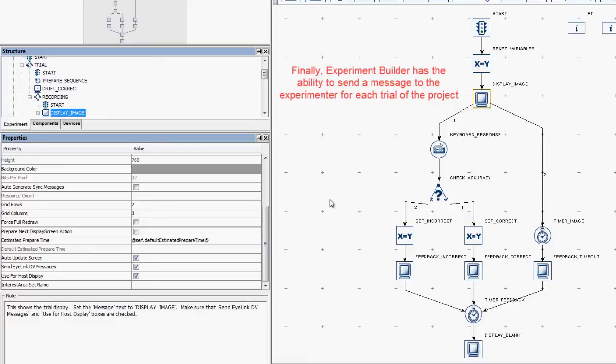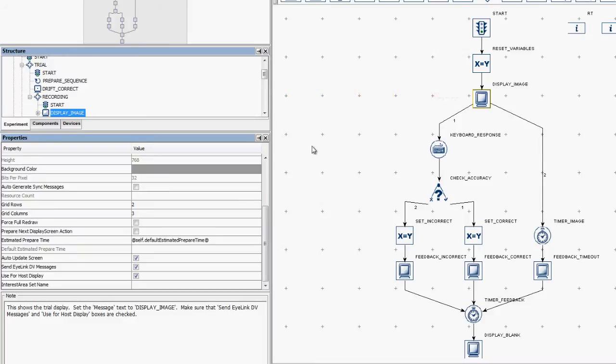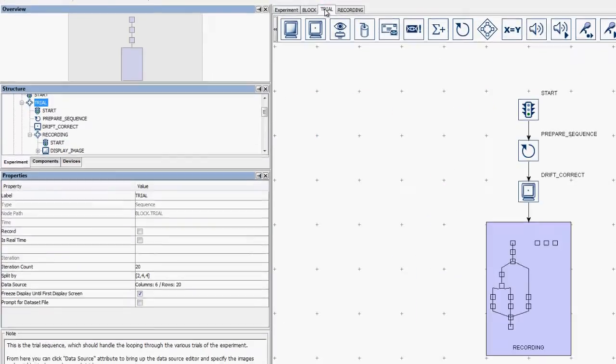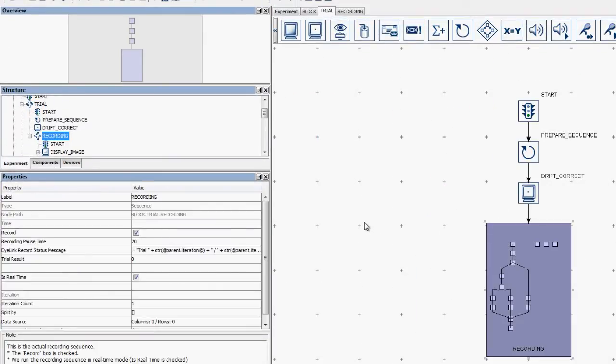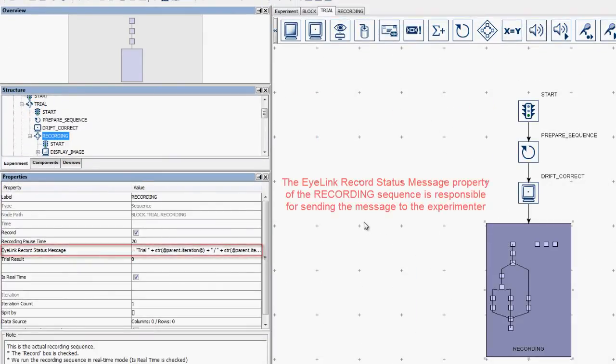Finally, Experiment Builder has the ability to send a message to the experimenter for each trial of the project. The EyeLink recordStatusMessage property of the recording sequence is responsible for sending the message to the experimenter.